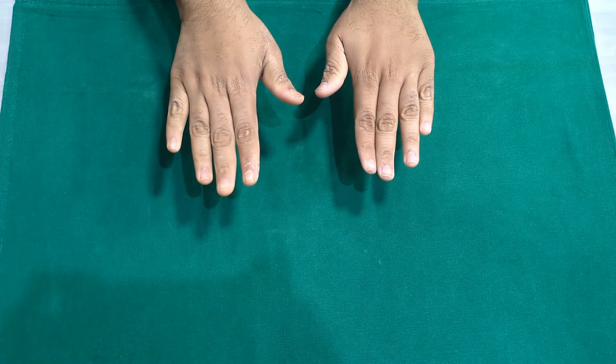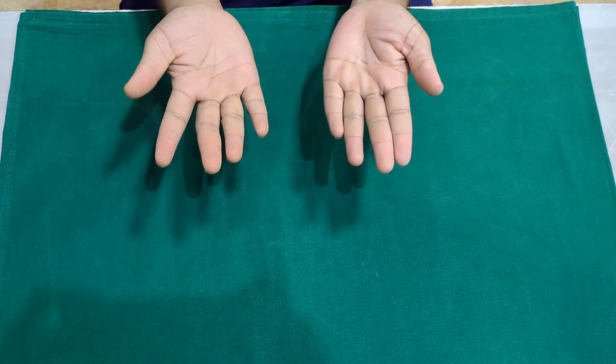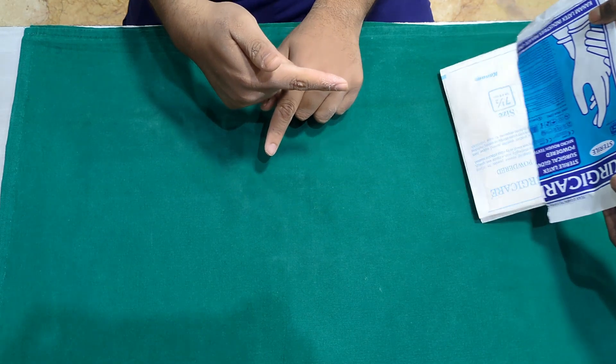Make sure your hands are properly washed and sanitized. Dry your hands before putting on the sterile gloves. Tear the package and slide the second package out onto the cloth.